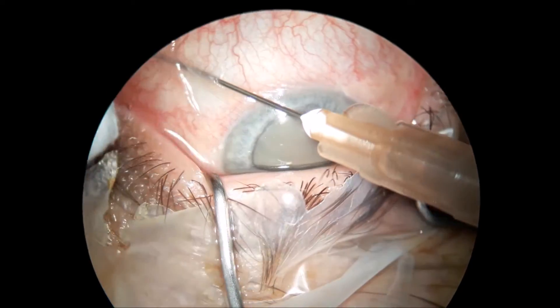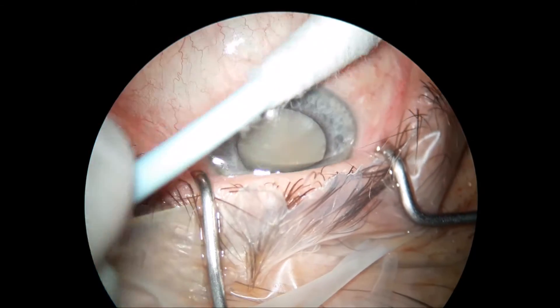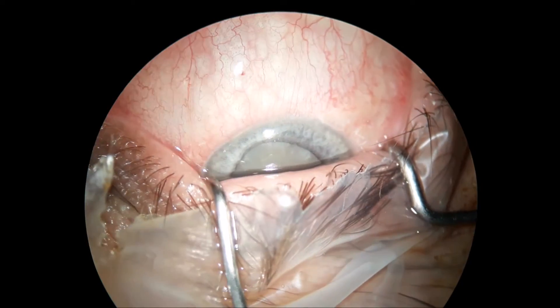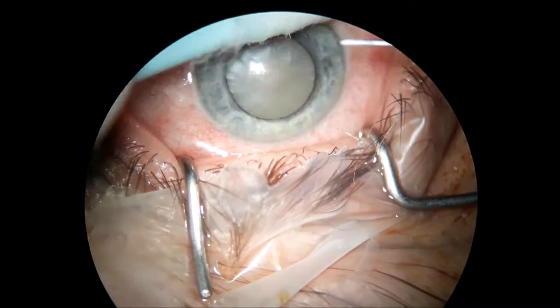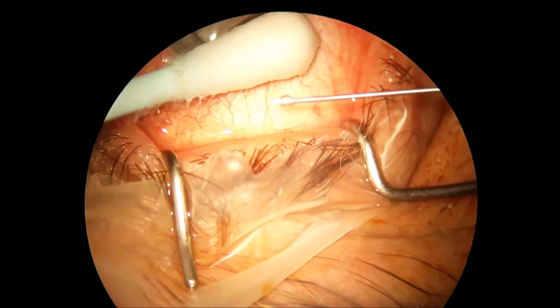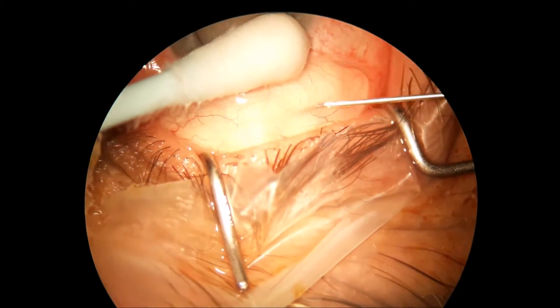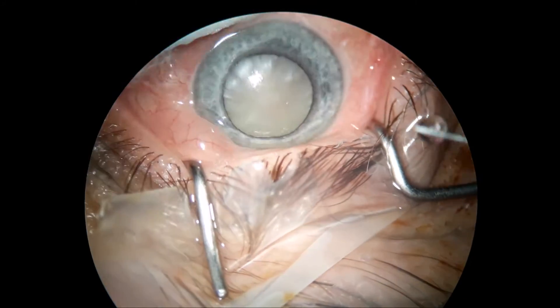Dear colleagues, this is another intumescent cataract done in sub-tenon anesthesia. Notice the very shallow anterior chamber and the fact that the iris is not very well dilated.